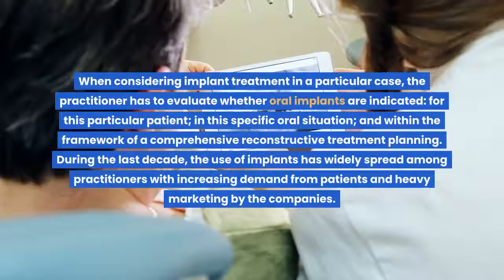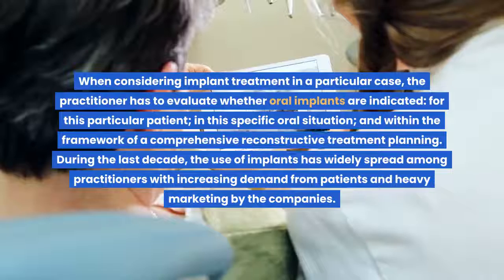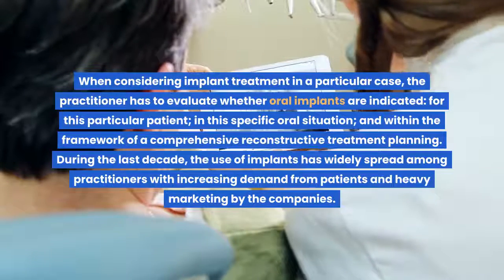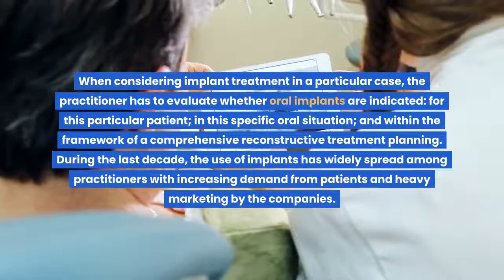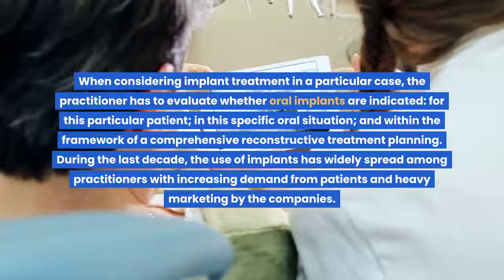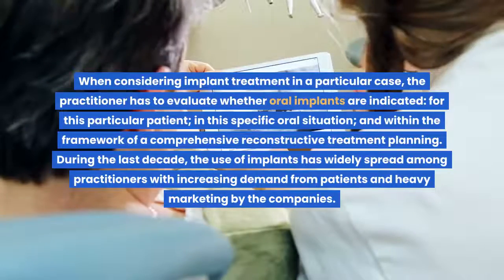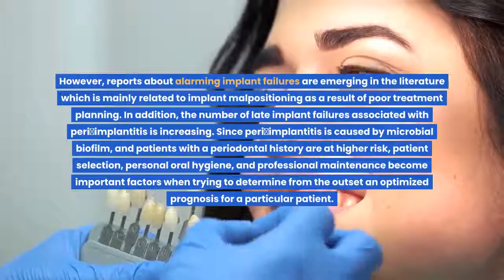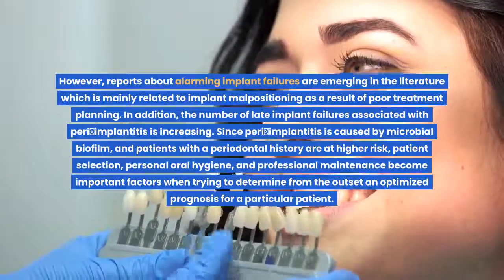When considering implant treatment in a particular case, the practitioner has to evaluate whether oral implants are indicated for this particular patient, in this specific oral situation, and within the framework of a comprehensive reconstructive treatment planning. During the last decade, the use of implants has widely spread among practitioners with increasing demand from patients and heavy marketing by the companies. However, reports about alarming implant failures are emerging in the literature, which is mainly related to implant malpositioning as a result of poor treatment planning.